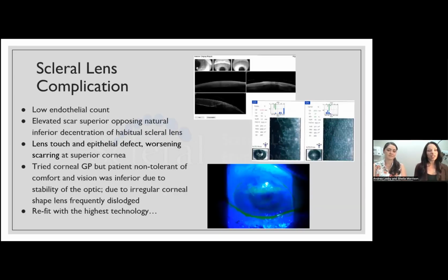Now, also, I had tried a cornea lens too, because at one point after we started her scleral fit, I did start her with a standard fit with the diagnostic fitting set with a fairly small diameter lens. She was also teeny, so her HVID was really small. Her lids were really tight and small, and dexterity wasn't great. So I really tried to get away with a fairly small scleral lens. And in the end, I think we landed on one that was only about, I want to say, 15.8 millimeters or something like that.